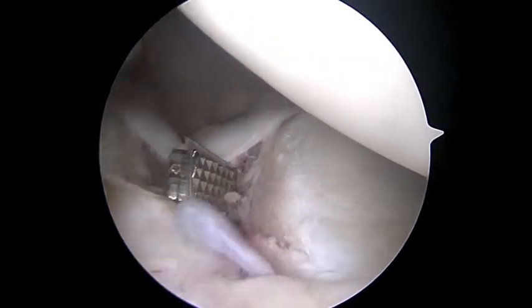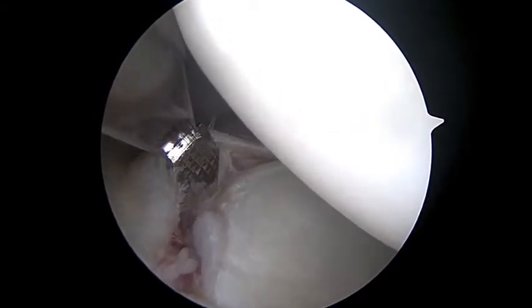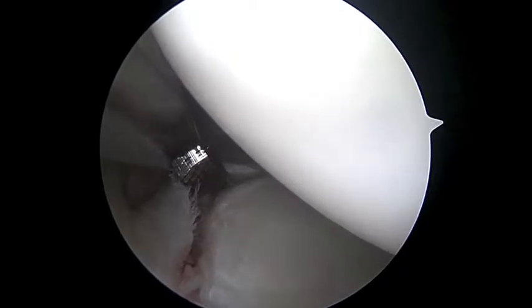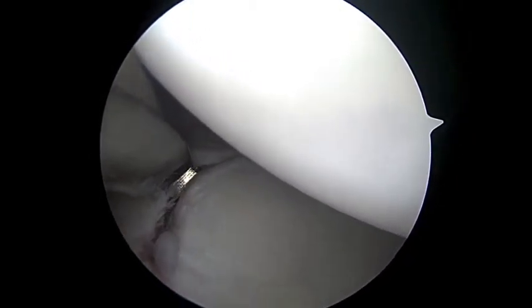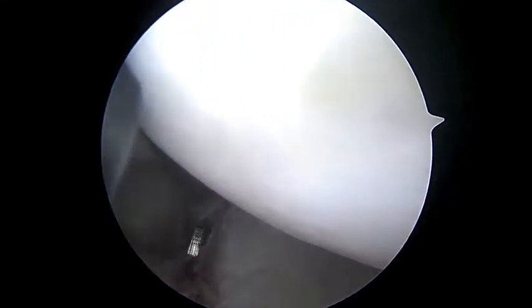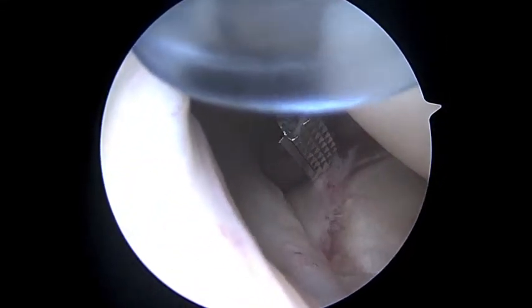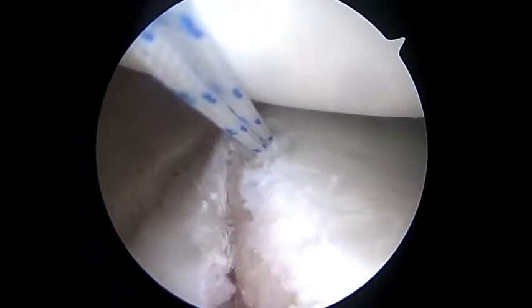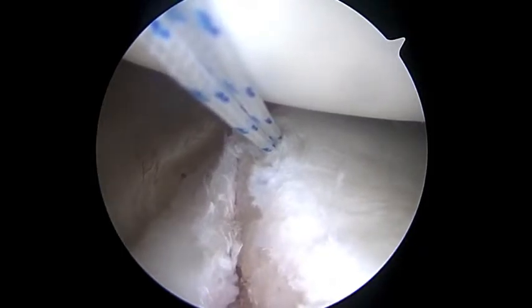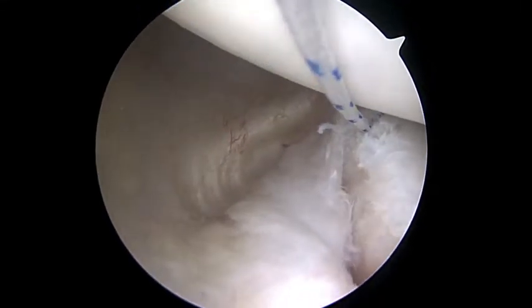Here's a pretty good demonstration of a Bankart lesion. I really haven't removed or debrided anything yet — this is just probing the injury, and it's all just sitting there detached from the bone. Here are the sutures coming out of the third anchor — this is the first anchor on the front line. Now we're going to reach in and take out one of the sutures, and start making stitches in the capsule here in the front.